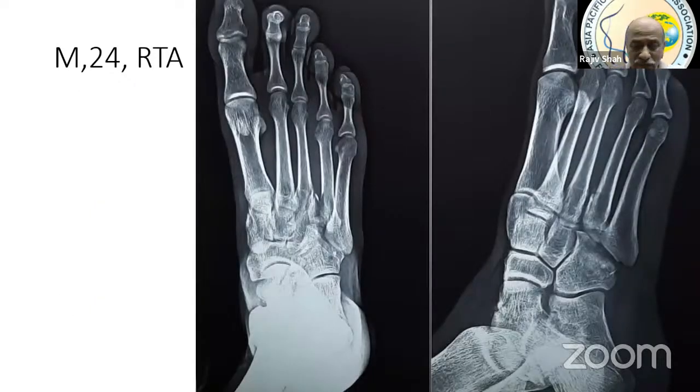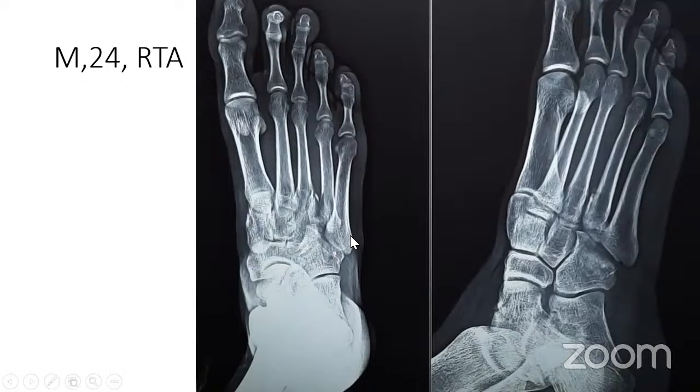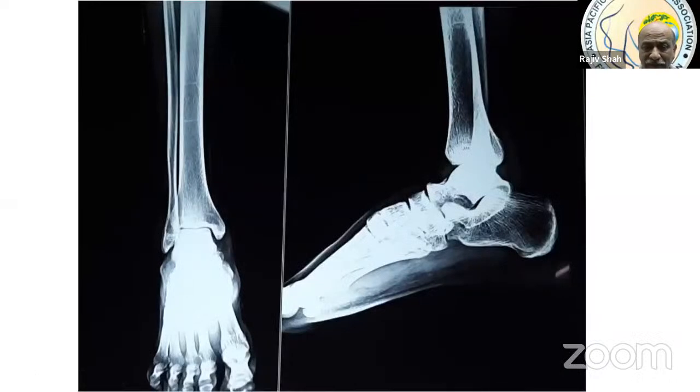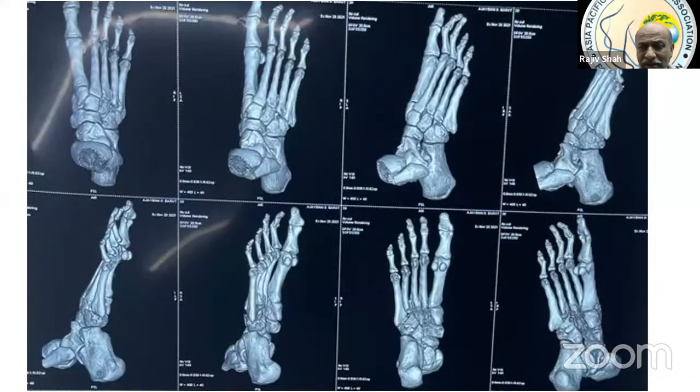I'm going to show you some cases of cuboid fracture. Now, this was a 24-year-old male who presented to us with a road traffic accident. So what all injuries does he have, anybody? First, second, third cuneiforms, cuboid, and also base of third and fourth metatarsals? I am not sure whether there are injuries to the base of second, third metatarsal, but definitely there is a crush fracture of the cuboid. These are his ankle X-rays, and this is the CT scan, which shows definitely a crush fracture of the cuboid.